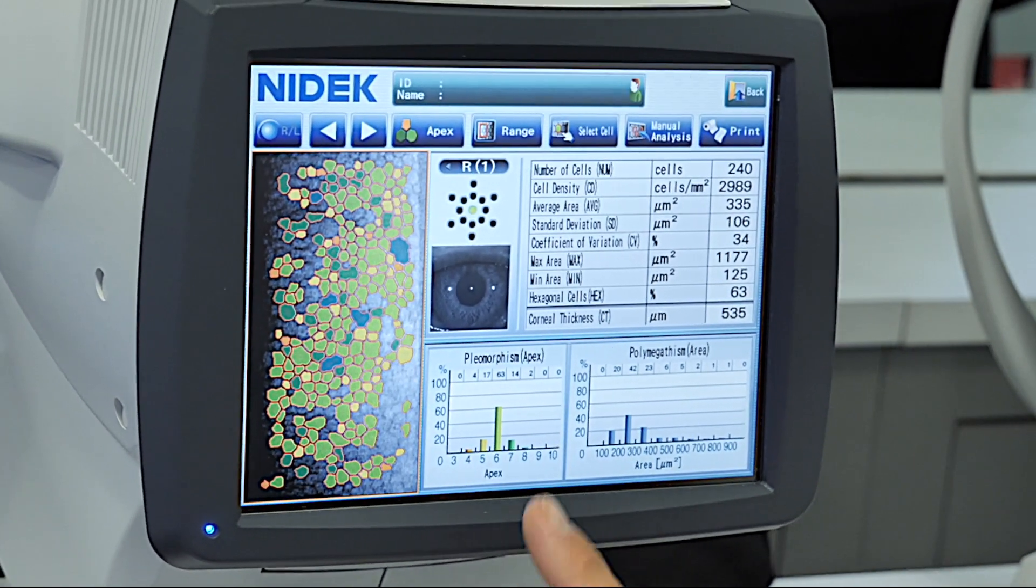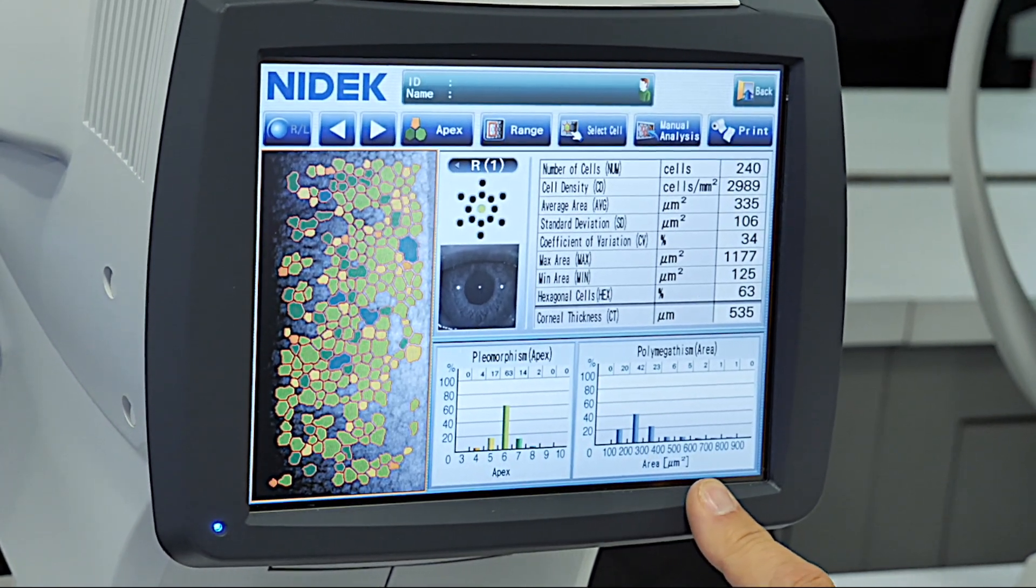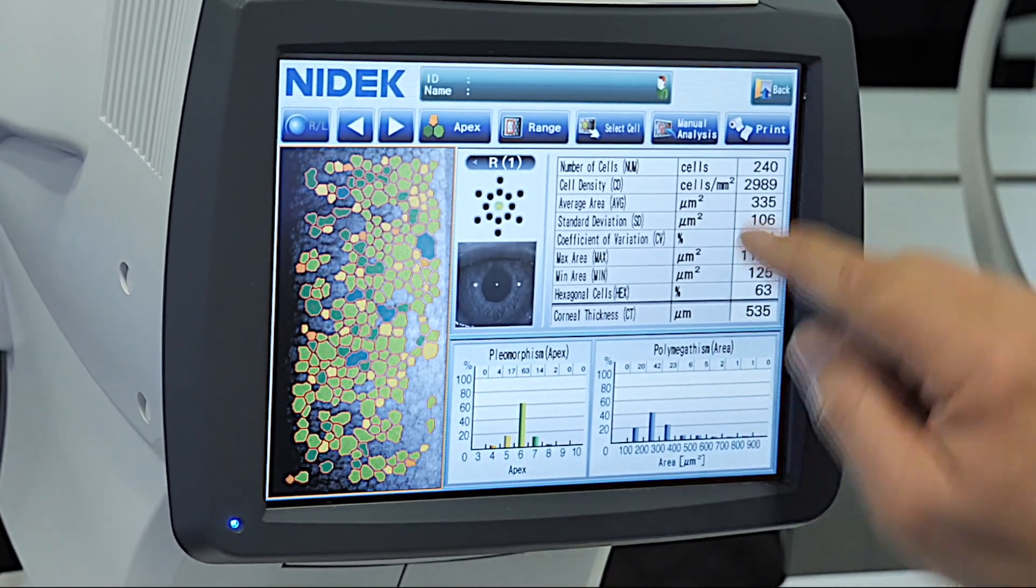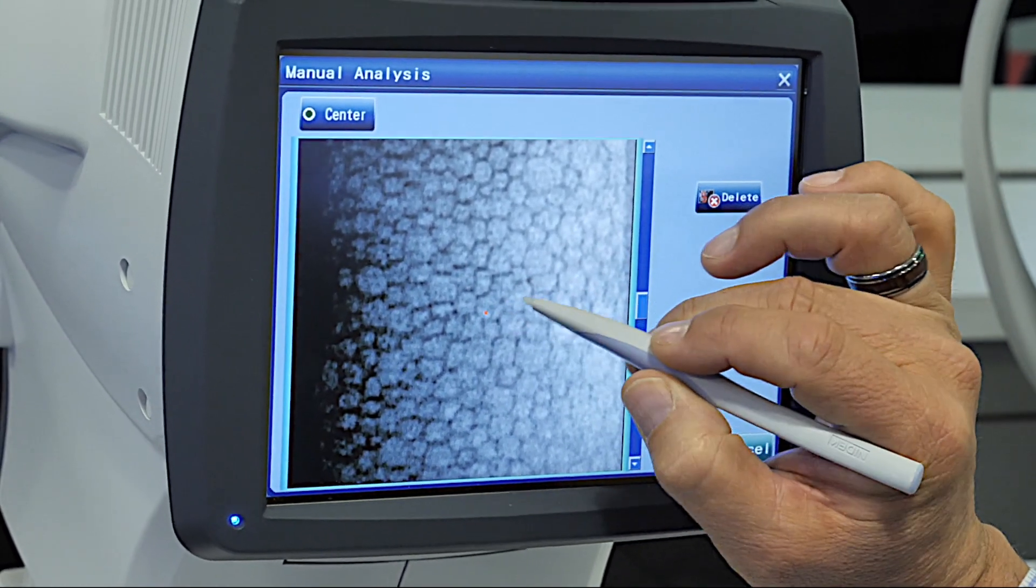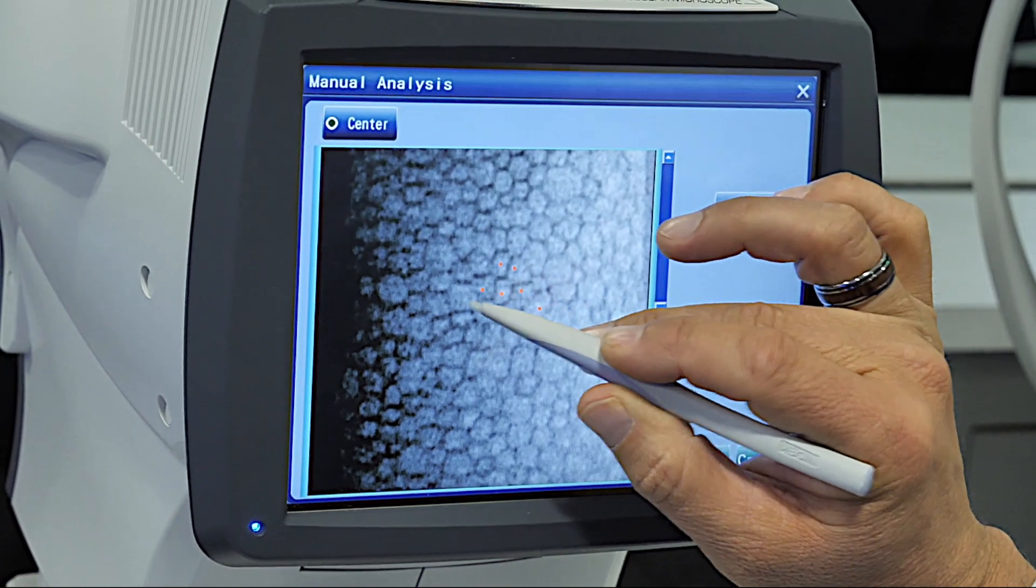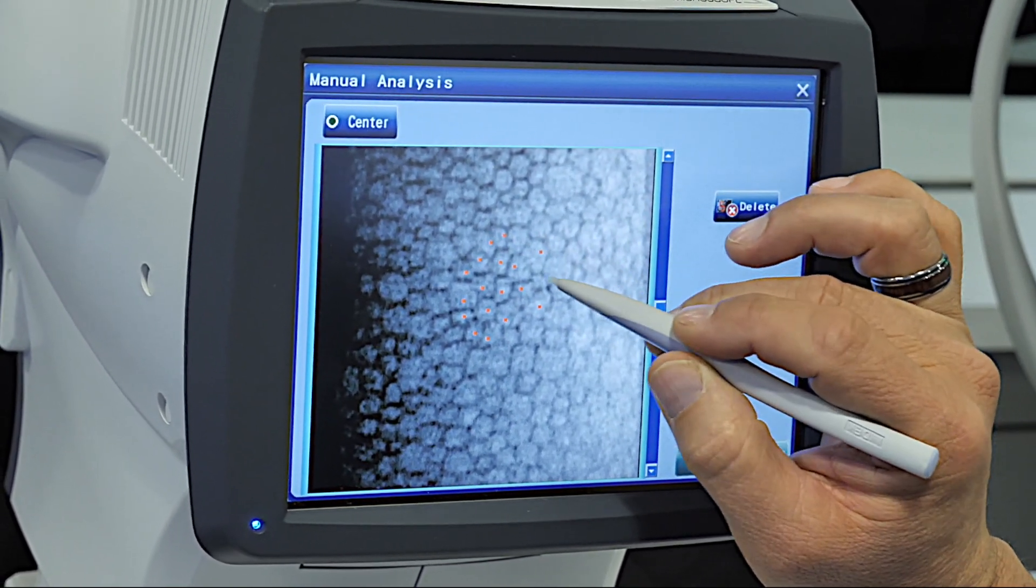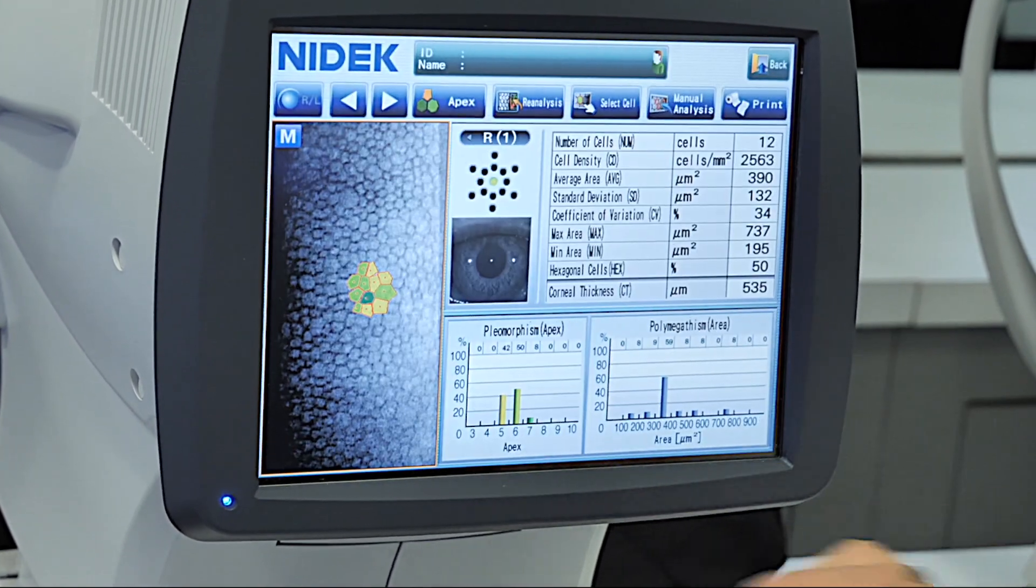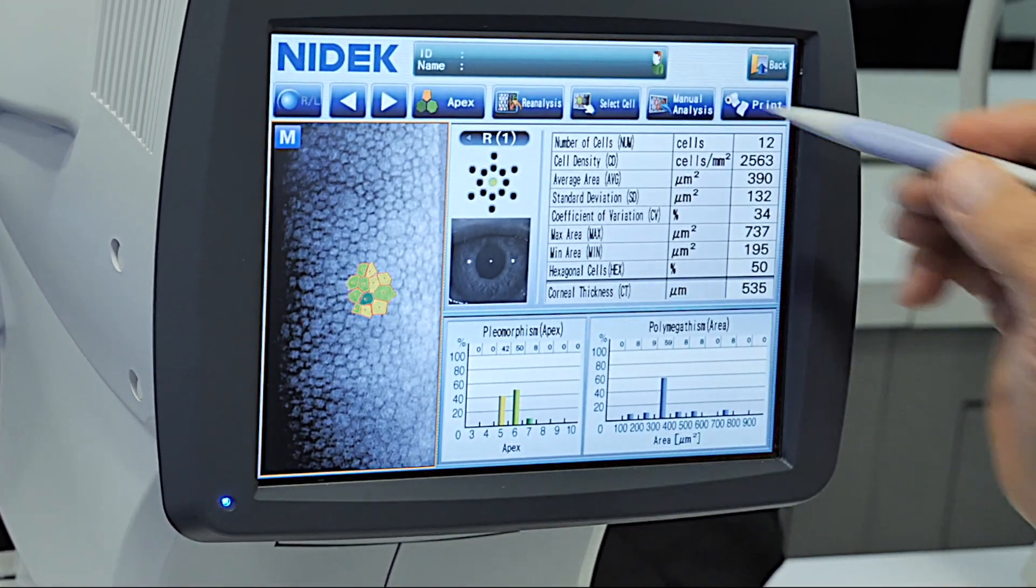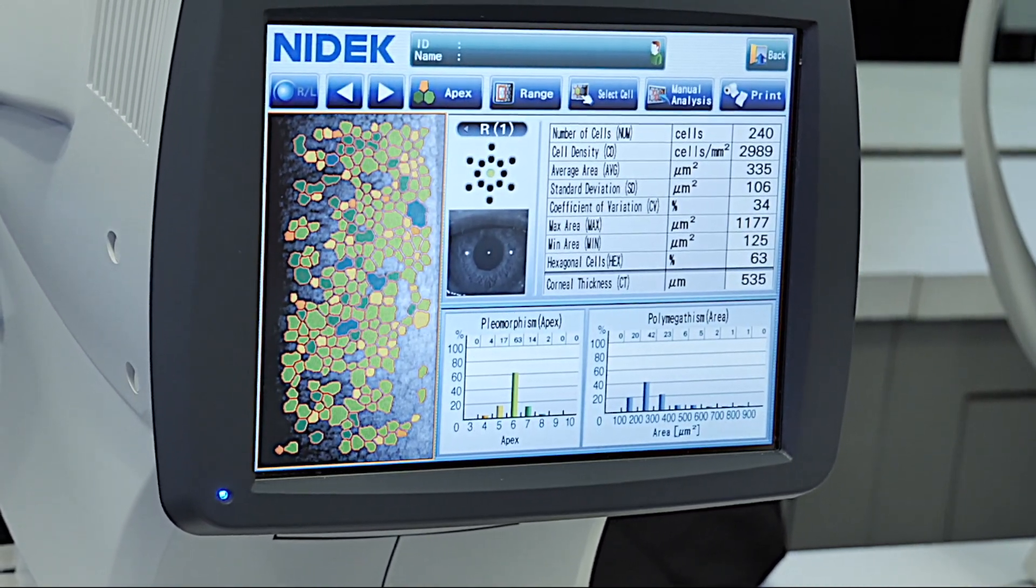With all that information, we're looking at pleomorphism and polymegathism. Not only does it do auto-calculation and analysis, but we can also select the cells if we would like to do a manual count. Sometimes it could fail if the patient has a lot of corneal pathology. So by selecting a certain number of cells, we can do an actual manual count, or you can select reanalysis to reanalyze your automatic analysis.